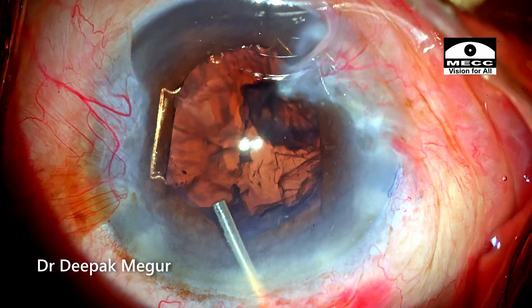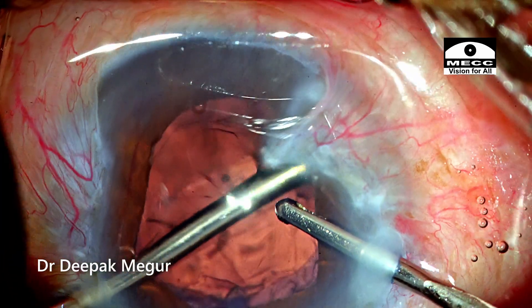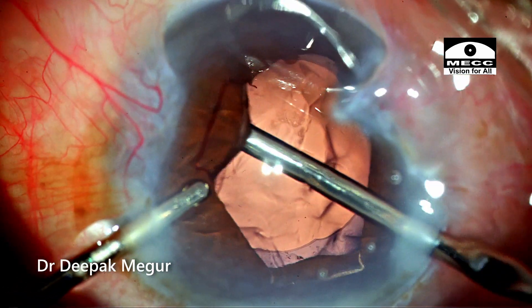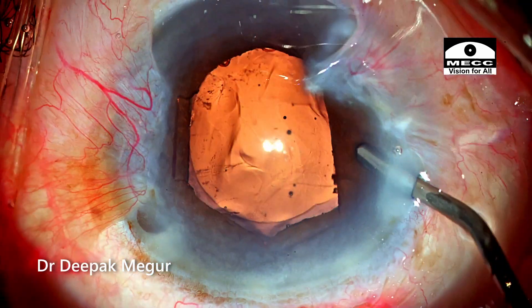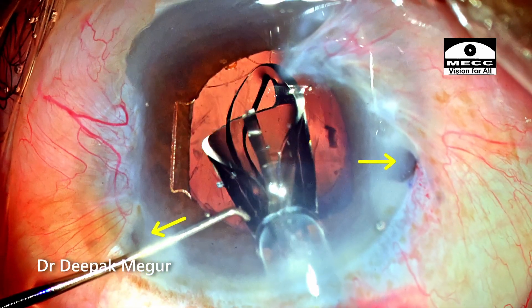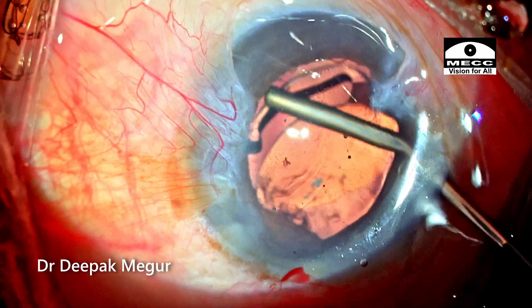Time to aspirate the cortex. Since visualization is quite good, it's not difficult to aspirate the cortex and it is completed quite easily. As I'm trying to inject OVD into the bag, the iris is trying to come out through both of the side ports even with the B-hex ring still on. A single-piece hydrophobic intraocular lens is implanted into the bag, and during this moment we can see the iris coming out through both side ports — the iris is showing its floppy nature now. The lens is gently manipulated into the bag.